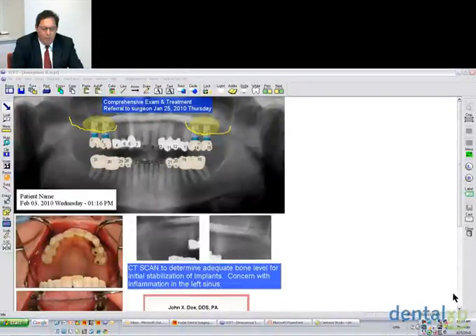Today it's my desire to deliver a message about some of the changes I think are occurring in dentistry as a result of CBCT, of CAT scans, of 3D. There's a large difference between going from a pixel, which is flat and square, and a voxel, which is a cube, but that's how it gives us volume.